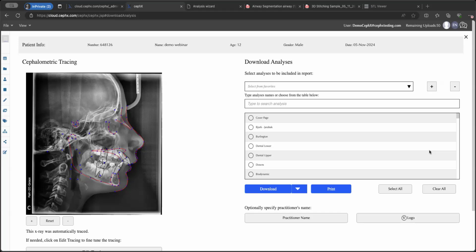Oh yeah, I see a last question here. We don't have any relation to metal artifacts. It really depends on the CBCT quality. Some CBCTs are very poor when they see a metal artifact, and some are very good. So it really depends on the quality of the CBCT.